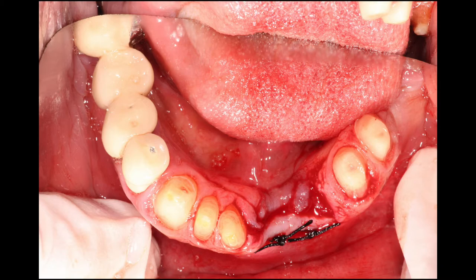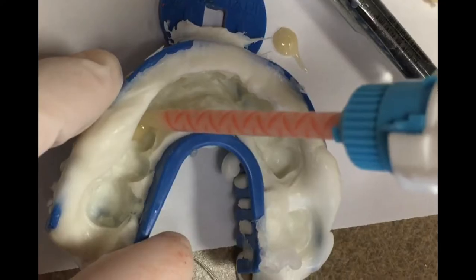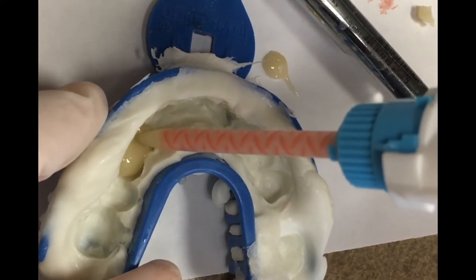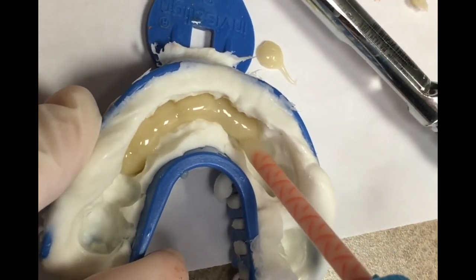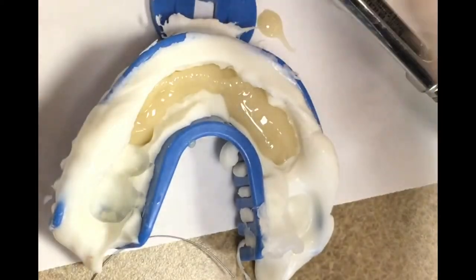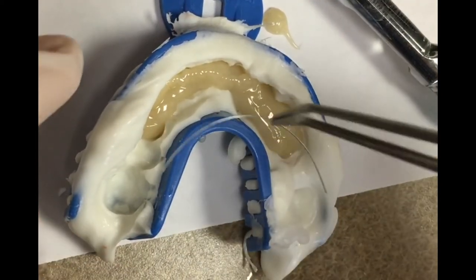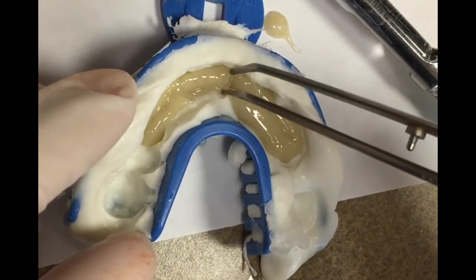At this point, after the bleeding has stopped, we're going to put the arch wire — which is just an ortho arch wire — we cut it and trim it to fit within the preliminary impression. Then we're going to place the temporary material. This is an integrity bisacrylic material. We fill up the temporary space within the preliminary, and then at the end we drop the wire in place, embedding it into the material and favoring it towards the lingual so it doesn't show on the buccal.